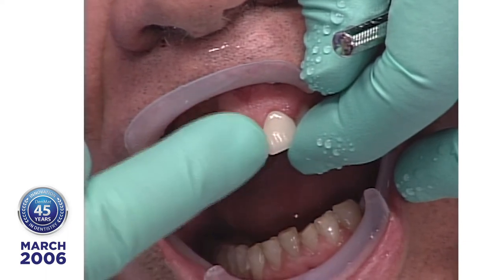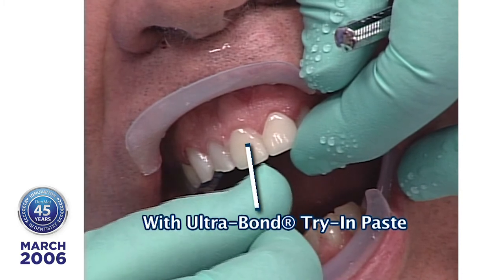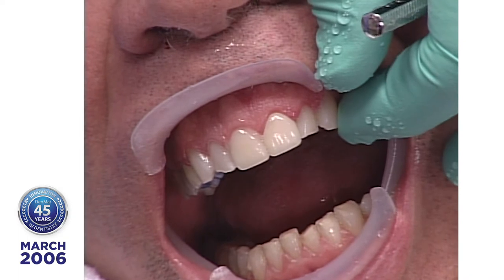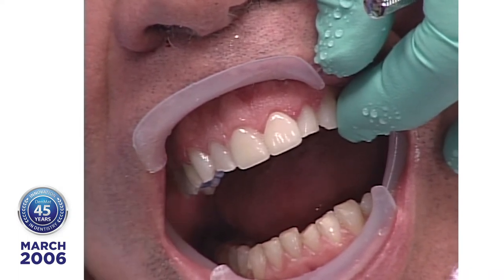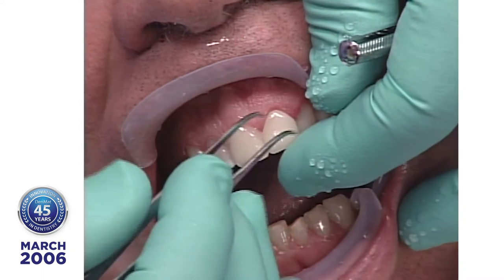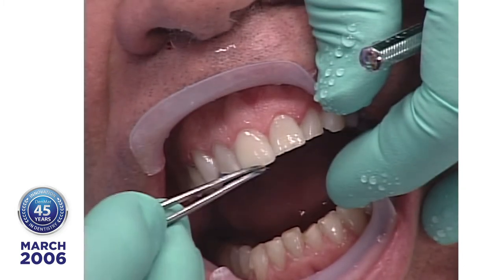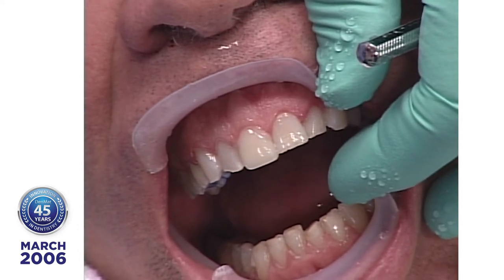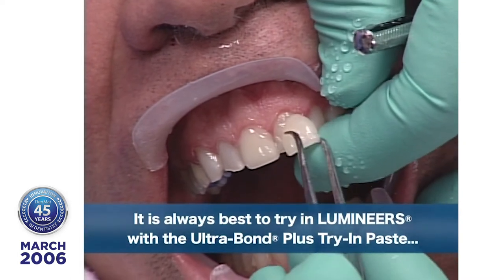Now we have the same shade Lumineer. And you can see the difference in the shade when you have the try-in paste on there. The reason for it is that once you exceed what they call the index of refraction, light stops going forward, it comes back to you, and it reflects off the back surface of whatever is there. Now when we put the Lumineer on with the try-in paste, the index of refraction is consistent with the tooth and the porcelain Lumineer.